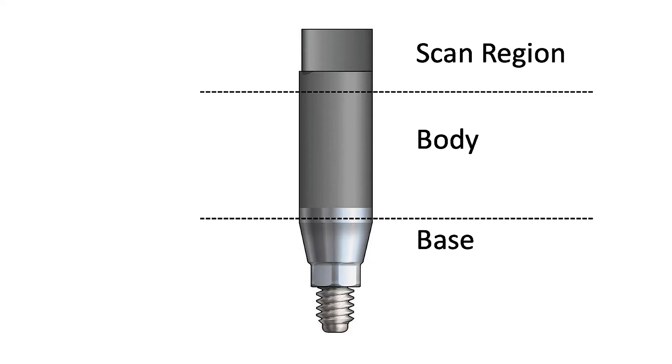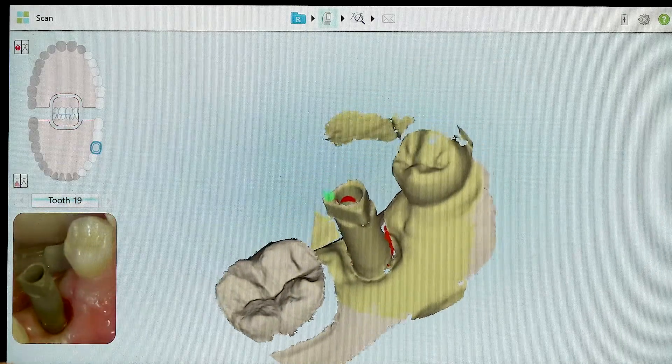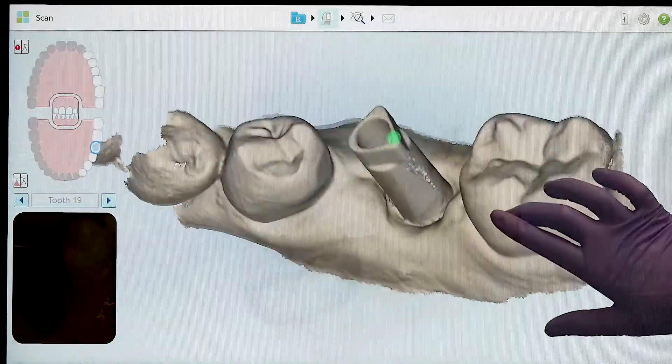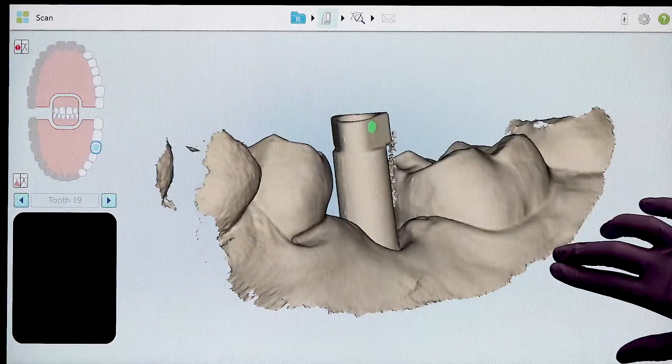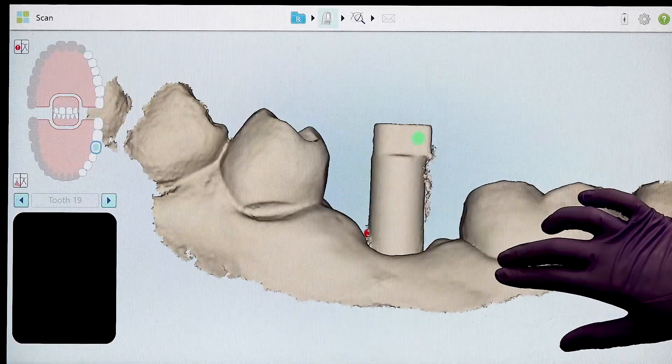The scan region is the main component used to digitally register the orientation and angulation of the implant. A flat side is usually incorporated into the design, creating an asymmetrical shape. This helps to index the scan body and improve the surface recognition performed by the laboratory software. Evaluate your scan to ensure that this scan region is clearly captured.